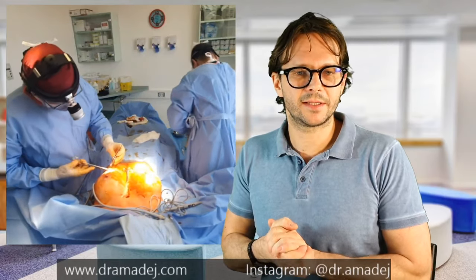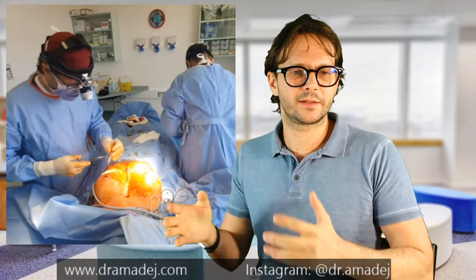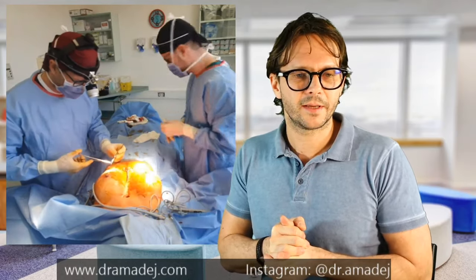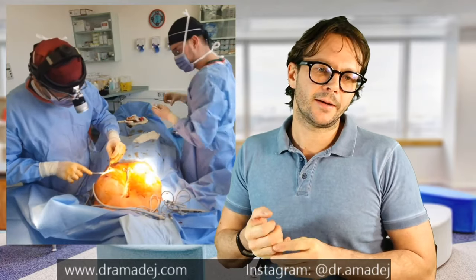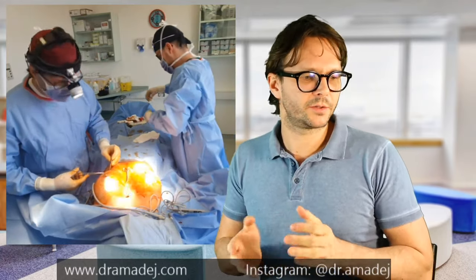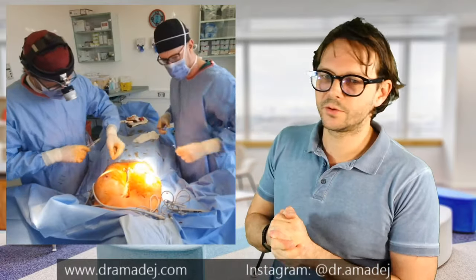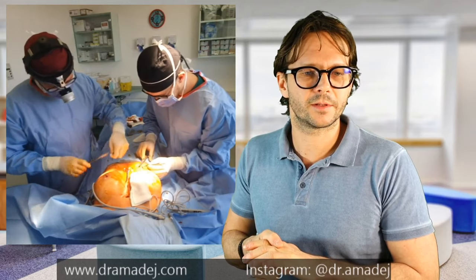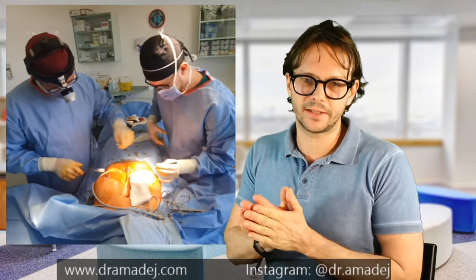My assistant is already packing the instruments and cleaning up, and now he will also start to suture. We've finished one side each.